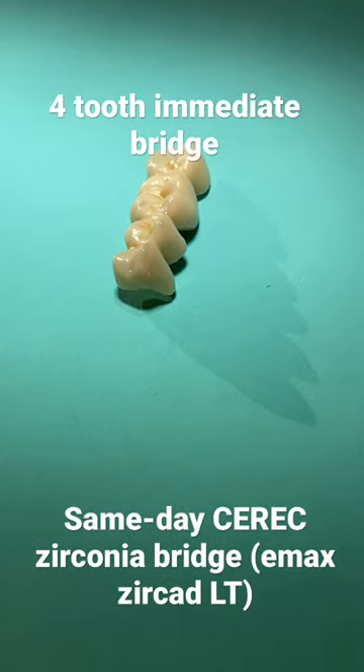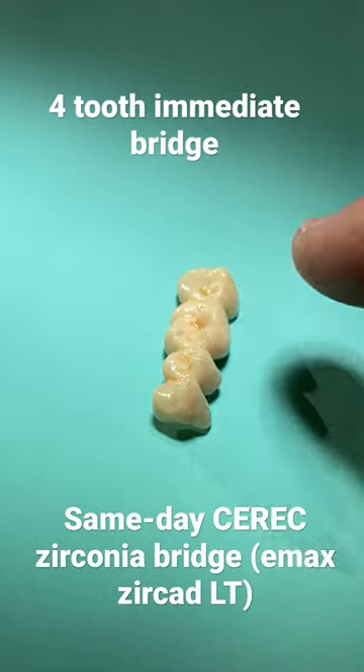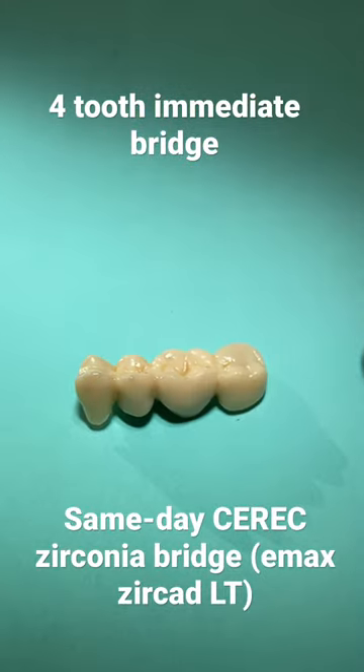Looking down the buccal corridor, what we're shooting for is that nice chameleon effect. We've got a couple of splotches of translucence that are a little too thick, which I'll polish off.